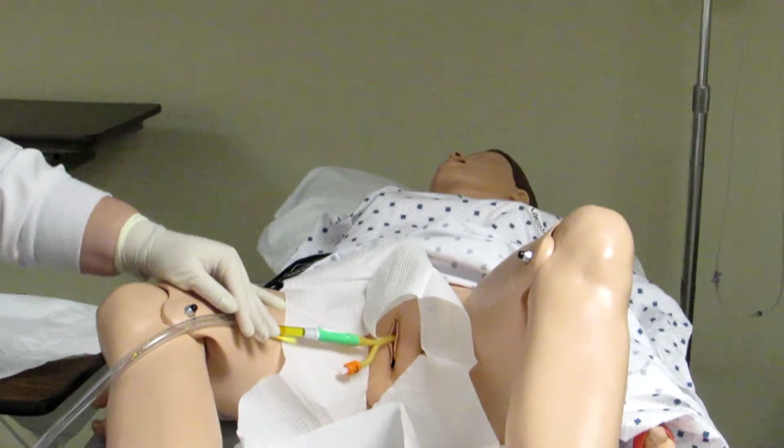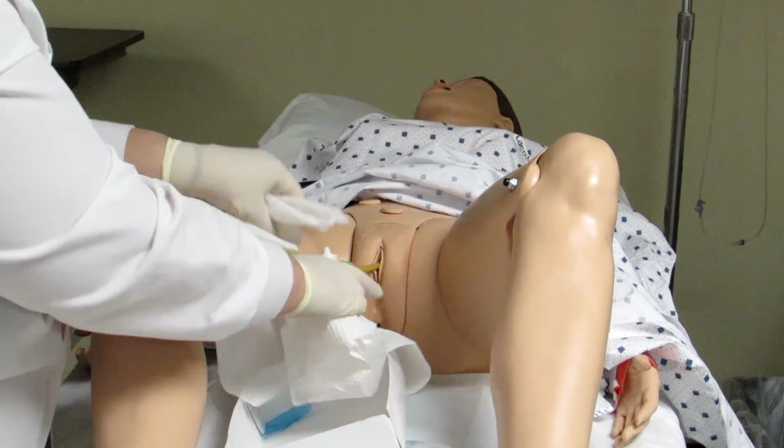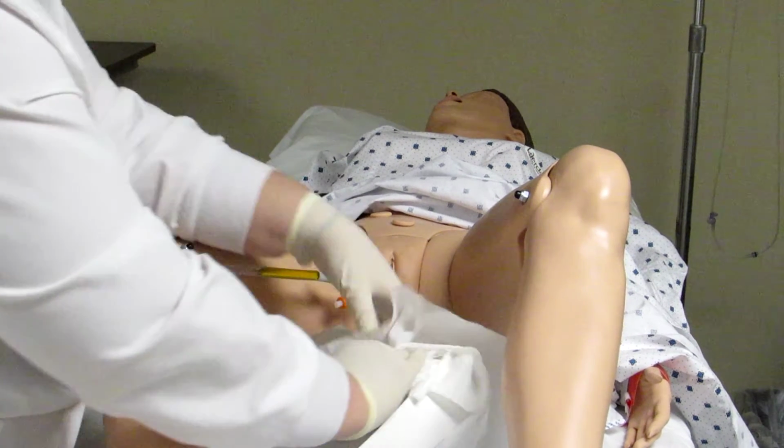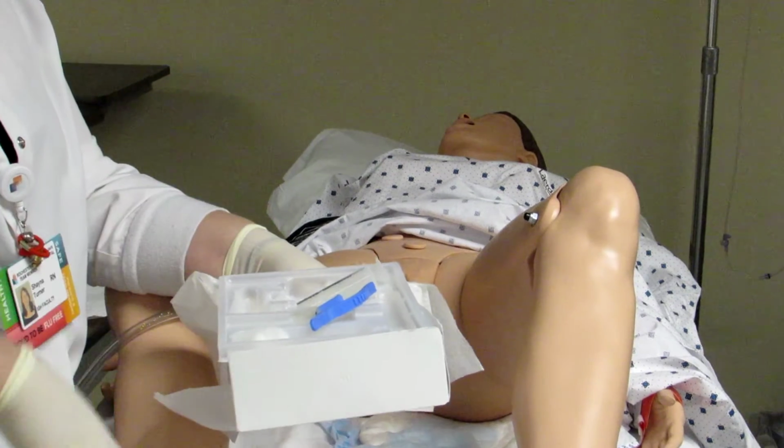You want to clean your patient up. You want to take down your drapes here. You want to probably have some soap and water handy so that you can clean the betadine and iodine off of your patient as well. Sometimes it can just be a little itchy and irritating to patients, so you want to make sure you clean them up nicely and give them some education about the fact that they have this catheter and now they shouldn't really sense the urge to void. They may occasionally, especially when it's first in there as their sphincter is adjusting to it being in there, but after a while they shouldn't even really be able to feel it in there.